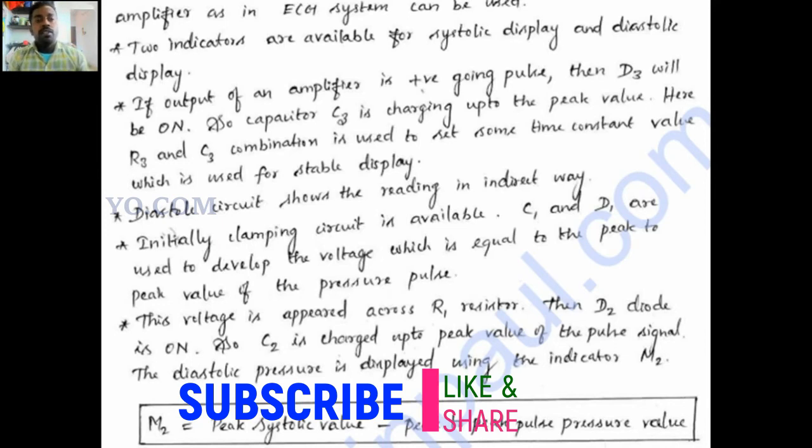Here the amplifier is the same as in an ECG system, that is a differential amplifier. Two indicators are available to display the systolic and diastolic blood pressure. One is the systolic pressure and the other is the diastolic pressure.